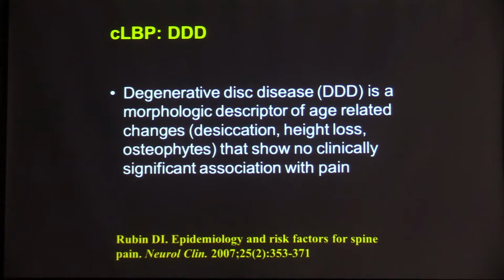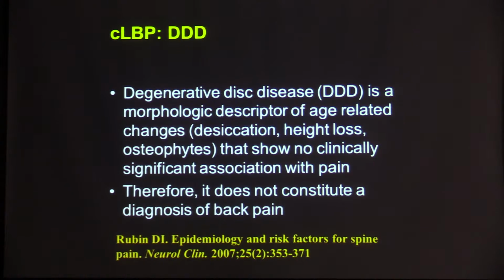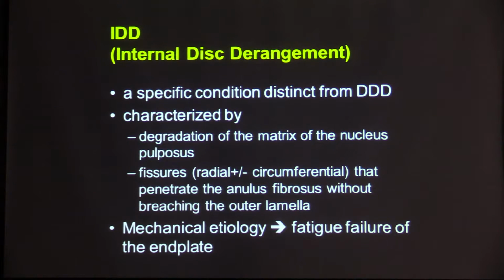They could potentially be pain generators, and we're going to talk about what other findings will help you increase the likelihood that they're painful. But simply saying that you have a degenerated disc, and this gets along with patient education, and in the U.S. it's a big deal now, and many patients are contacting radiologists to also explain their exams. But typically, it's the surgeon or the pain management doctor. They read a report. Dr. Carrino said, "I have degenerated disc. Isn't that my pain?" No, it just means mostly that you're getting old, or that your disc has maybe potentially been injured, or you have a genetic predisposition to getting this. So by virtue of a radiologist saying degenerative disc disease, this is not a diagnosis of back pain. So we need to pull out other findings.